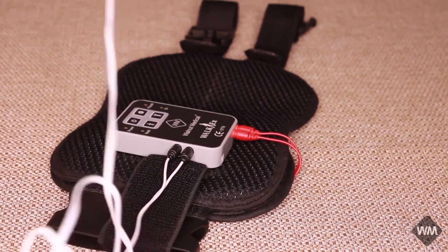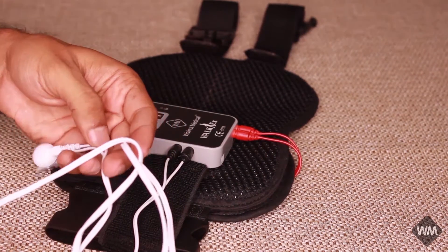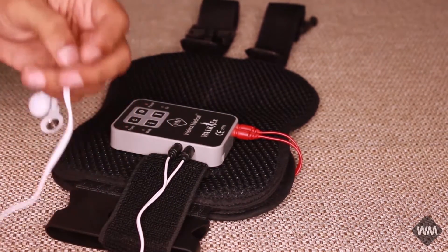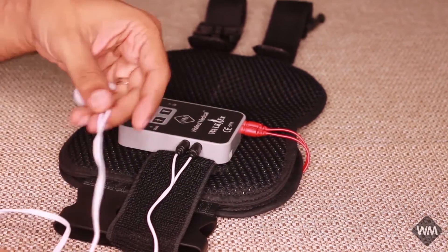The Channel 2 cable is pretty long and it can reach any part of the body, including the upper limb and other areas as per the need of the doctor.